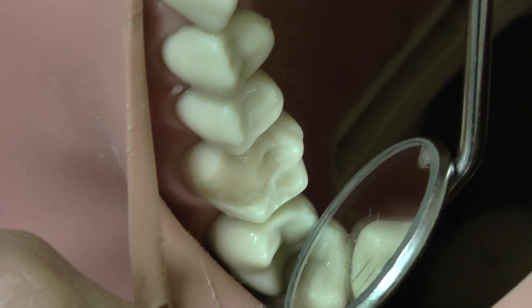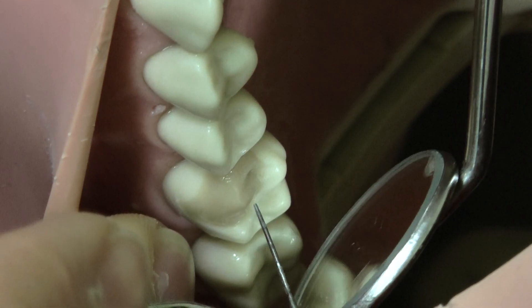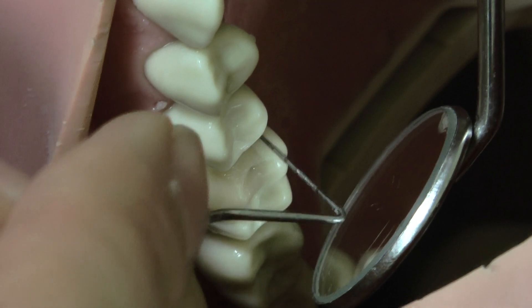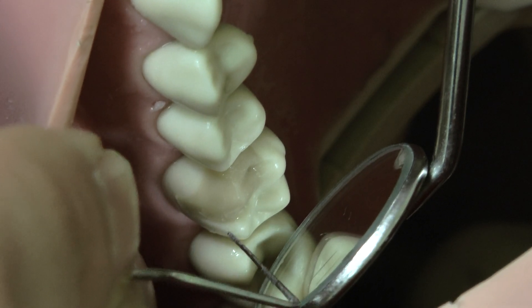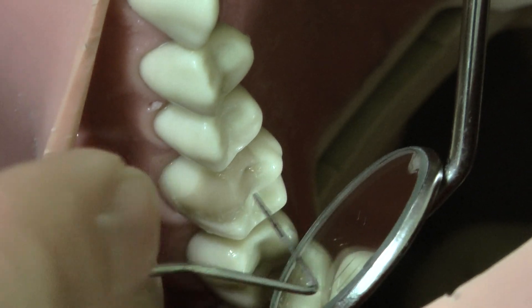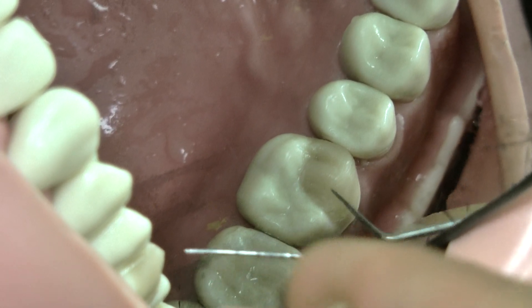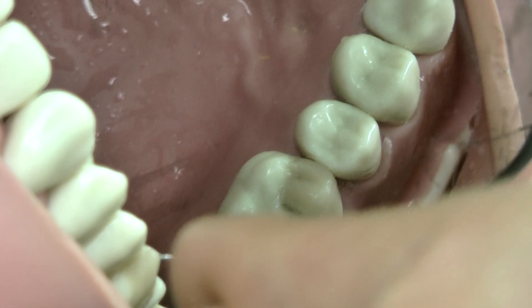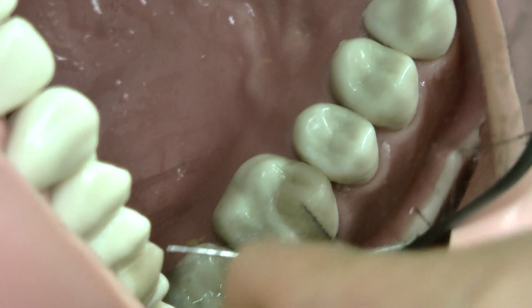The shaping with the bur is almost finished — we have the marginal ridge and no excess in the interproximal. The fact that I wrapped the mylar strip tightly every time means I don't have any excess there, which made the job much easier. Now I can just polish it with a white stone or Sof-Lex disc for a couple of minutes. This is the view of the occlusal surface — the marginal ridge, the cusp, and buccal fissure anatomy. You can always look at the contralateral six and try to copy it as much as possible. Note that this video deliberately uses a darker shade of composite so it can be seen in contrast with the tooth.